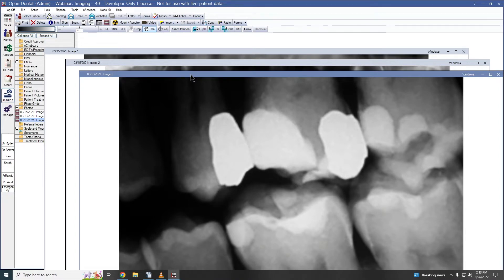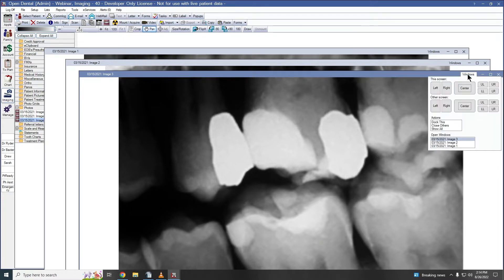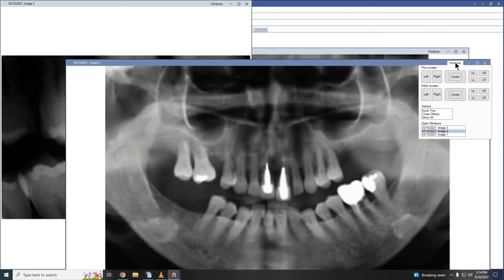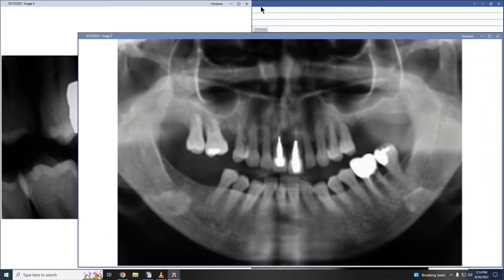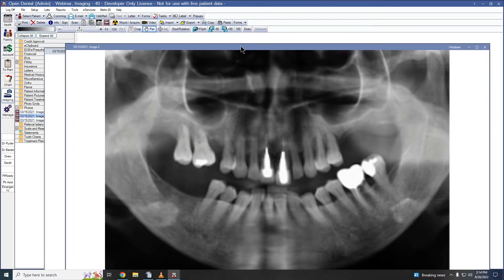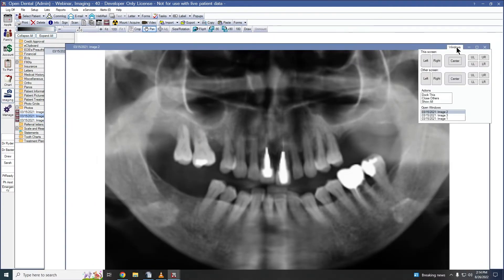We can also designate a specific area of the screen to display the image by clicking the Windows button in the top right of our title bar. From here, I can select where on this screen or on my other screen I would like my image to display. I can choose Dock This to redock the image, select the title bar and drag to undock the image again, select Close Others to close all other open images, or choose Show All to open any minimized images.